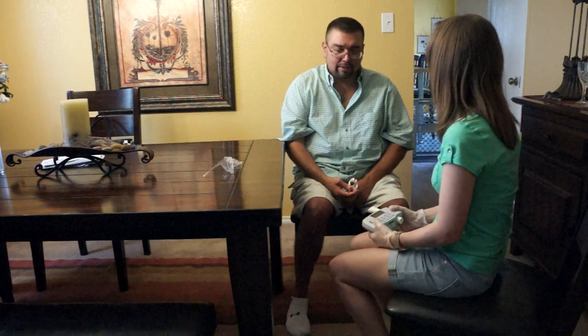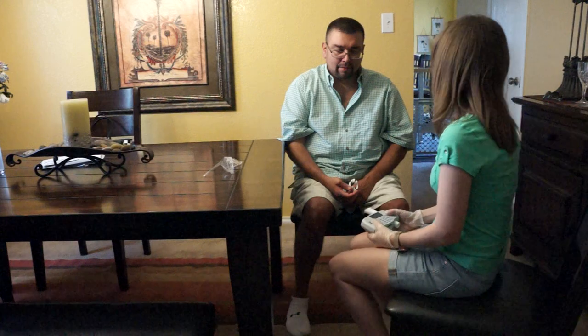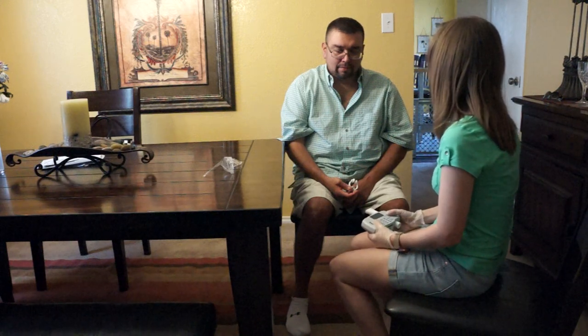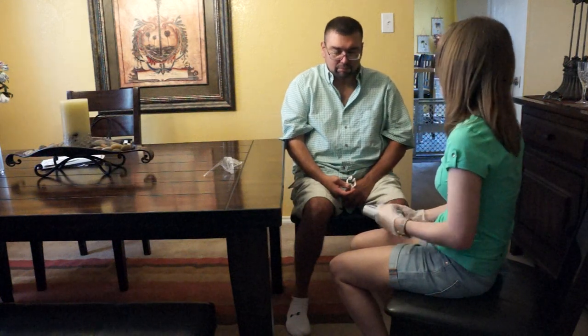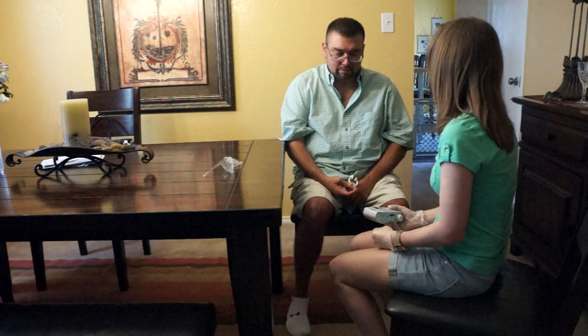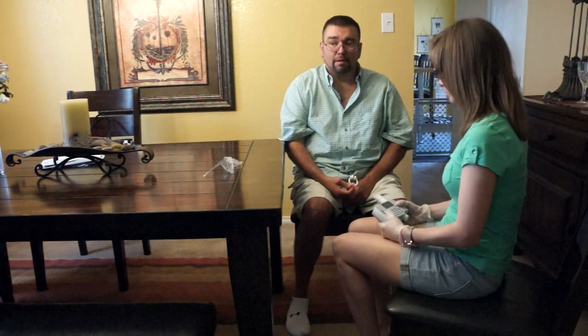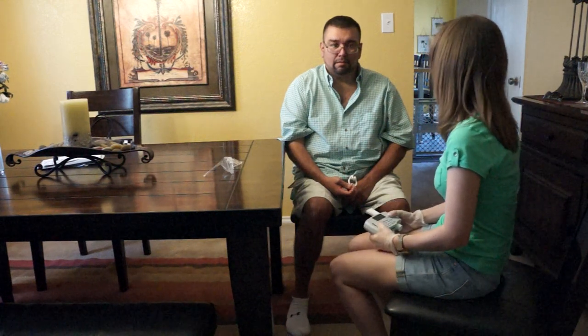Are you okay? Yes. Okay, so I'll wait a minute, let you catch your breath a little bit, and then you can do it again. So hard and fast, like you're blowing out a million candles in that first breath. I know it's easier said than done, right?